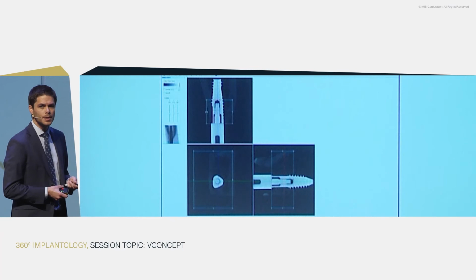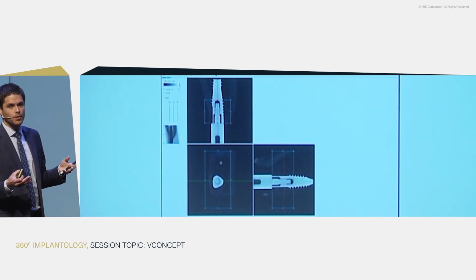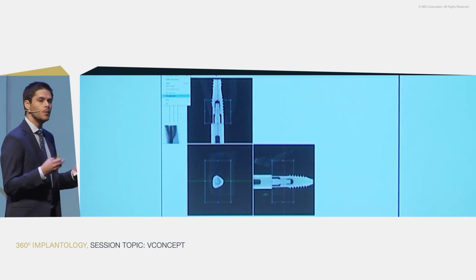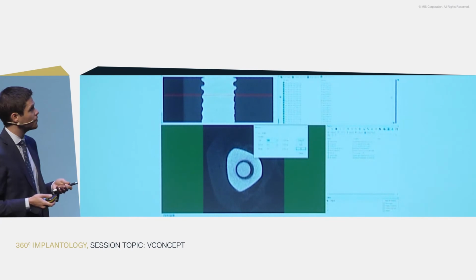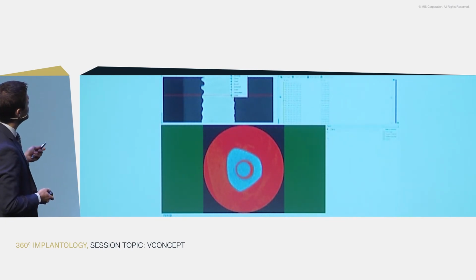And this region of interest is going to be, as I discussed before, involving both the mesial and distal and the buccal and lingual. So here, what we want to assess is a wider region of the sample, and basically here our two objectives are going to be to analyze the bone-to-implant contact. When we analyze bone-to-implant contact in the past, we used to have only one histologic slide. Now we have the opportunity of analyzing this through this technology, where you can see we're looking at 360 degrees around an implant.